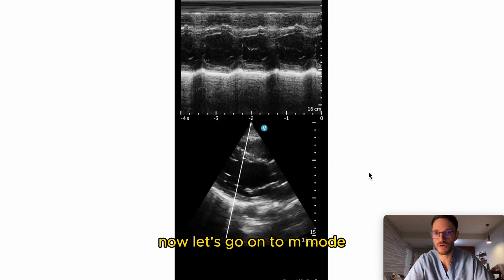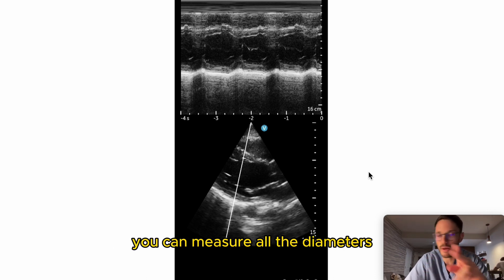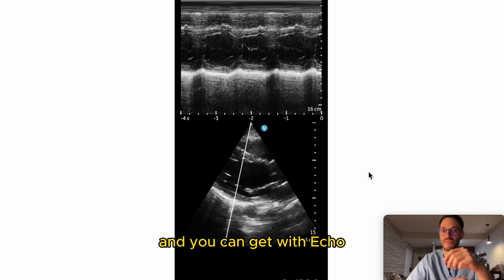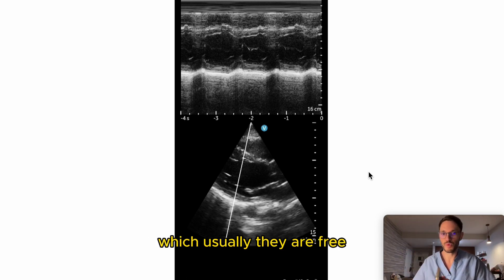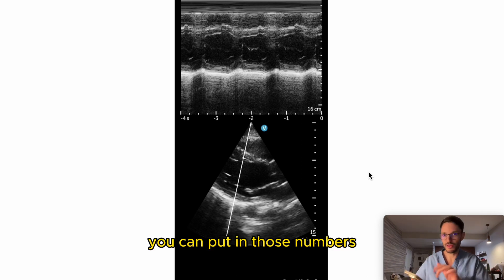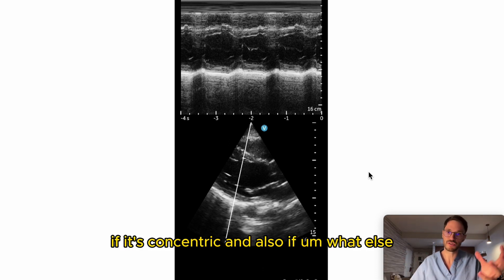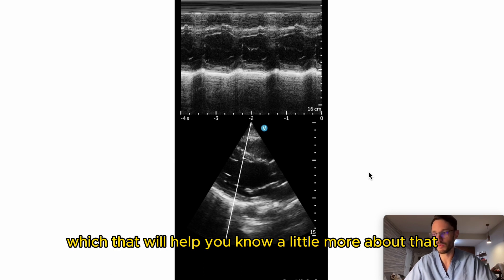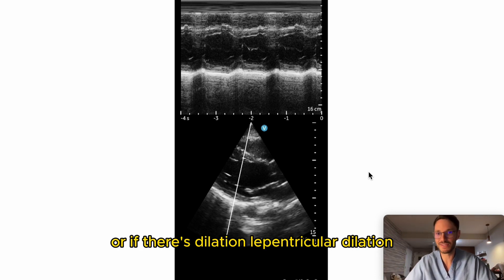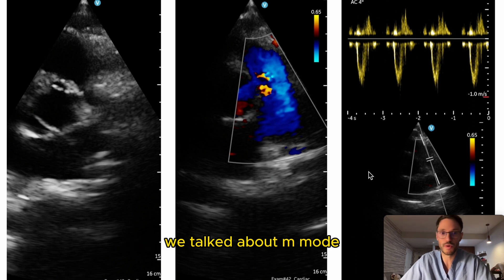Now let's go to M-mode — same long parasternal view. Here you can measure all the diameters and use EchoCalc or any free calculation app to input those numbers. You can determine if the patient has hypertrophy — whether eccentric or concentric — calculate cardiac mass, and assess for left ventricular dilation.